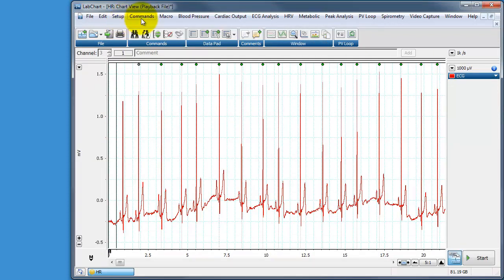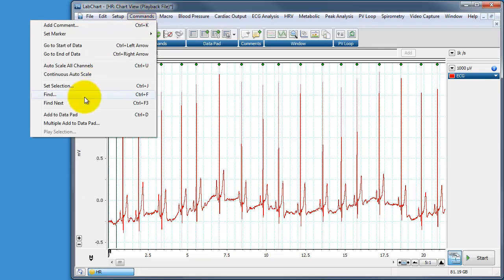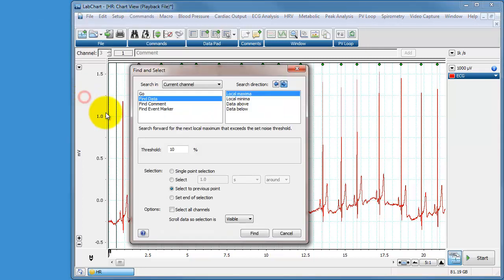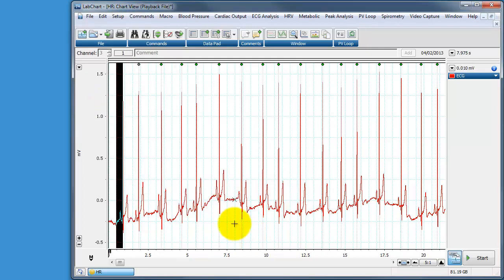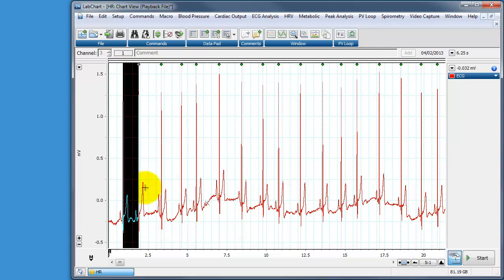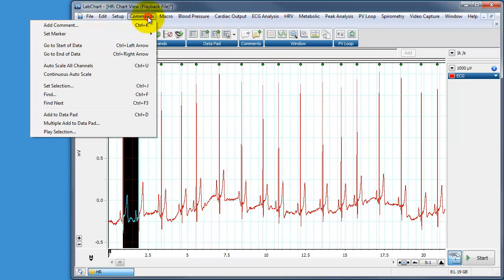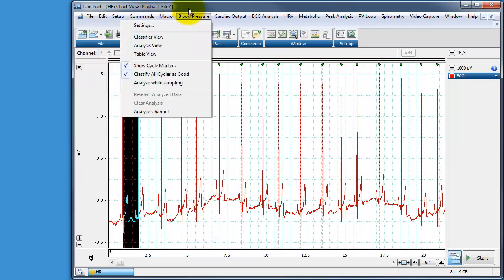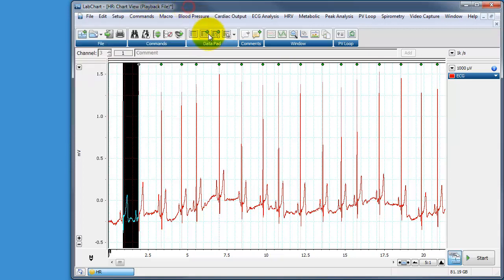Let's do that selection again. So command, find, and find that. Find it again. So that's our first R interval. We can add that to the data pad by choosing commands, add to data pad, or by clicking on the add to data pad button, or by pressing control D. So I'm going to press control D.